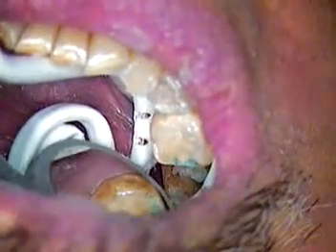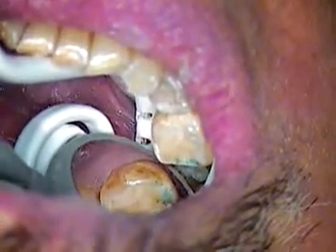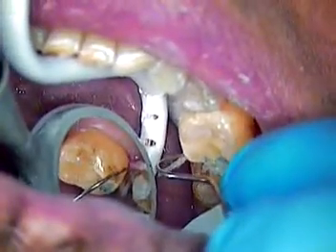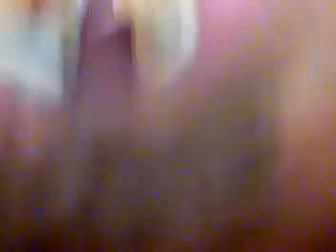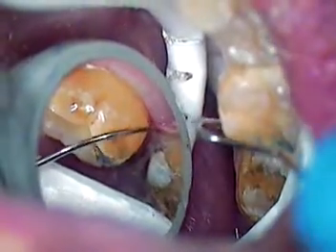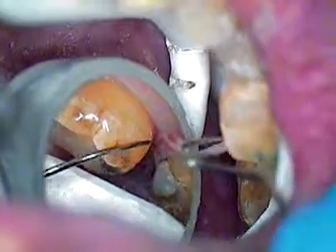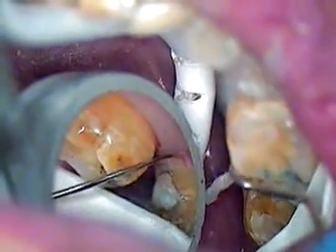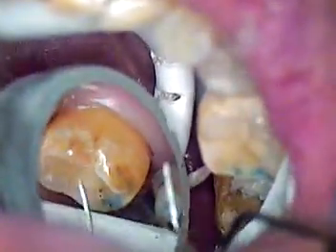It's in a non-aesthetic zone, so you just want to get something that blends nicely in there and is strong. Coming around the corner — let's see how much that tissue can actually tolerate coming in from an angle. You need instruments that come in from different angles. I like to use the explorer at times; sometimes I'll switch to that composite instrument, going in on an angle. We're not going vertically — not like prepping the tooth — just creating a little space.